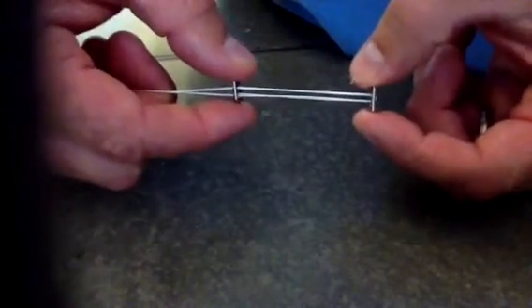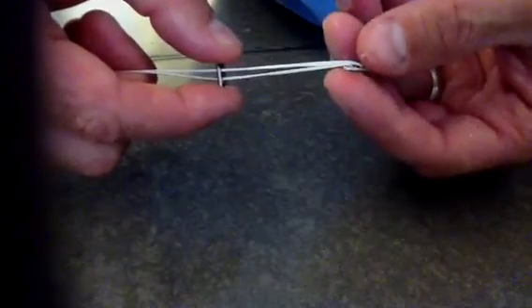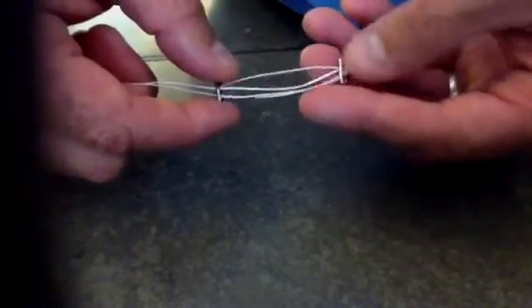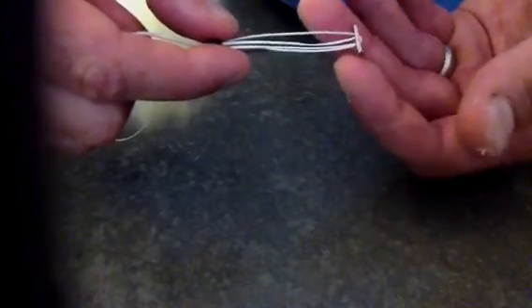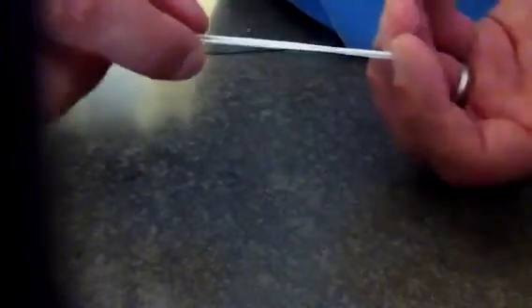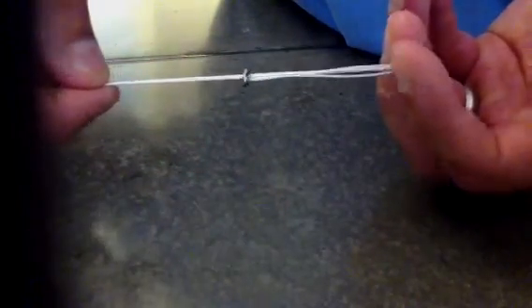You've got a syndesmosis device where I'm going to take this endo button, flip it, and pass it through with flipping stitches — you can toggle it just like you can for an ACL hamstring. When I get to where I want it and want to reduce the fracture, I pull on these two limbs evenly and as I pull, it reduces down to the other button. I get it as tight as I want, then tie a knot and lock it in place. The nice thing is it can be toggled, so you know it's flipped on the far-side cortex.